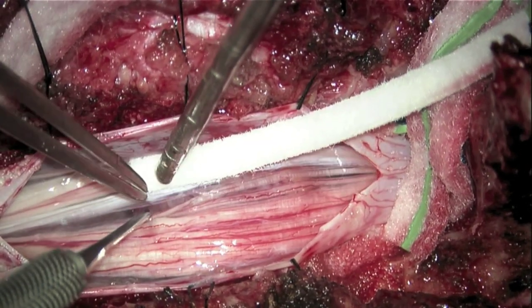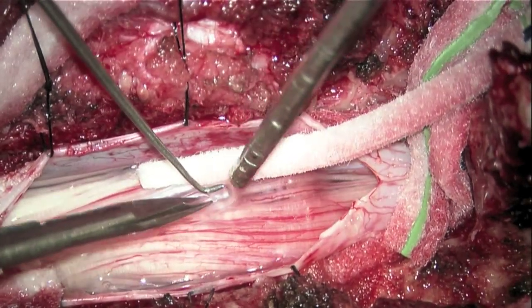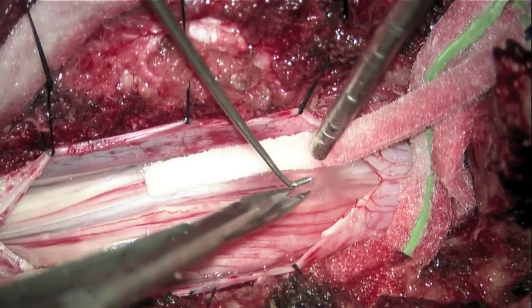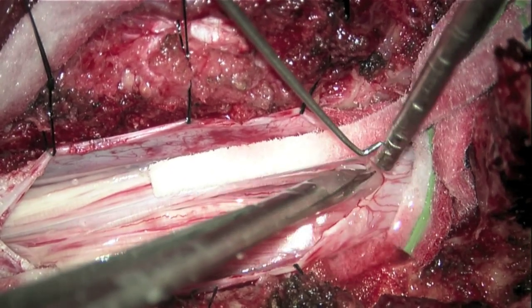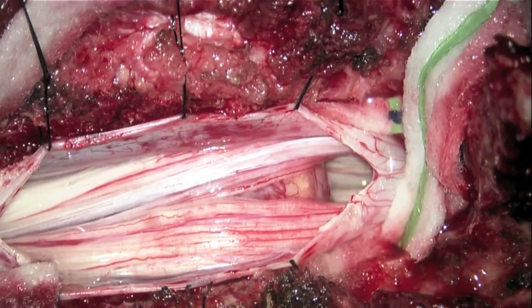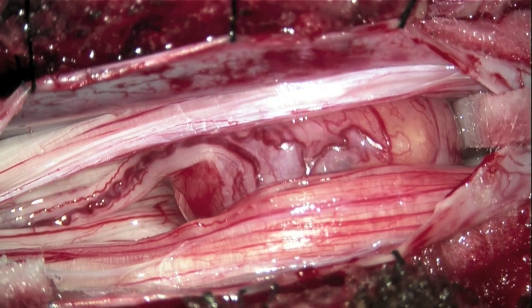Initial intradural exposure shows the tumor to be covered by some of the cauda equina nerve roots. The arachnoid is sharply incised and dissected to mobilize these roots to gain exposure to the tumor. The inferior margin of the tumor can now be clearly seen. The dorsal and rostral tumor margins are now exposed.